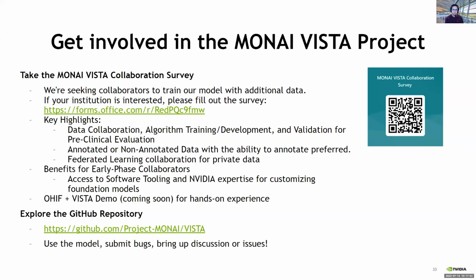One of the other things we're asking about in that survey, and I'm part of the team helping with this, is having a demo that we can stand up for you to test it out in its current form. Right now we have an OHIF plus Vista demo that is almost done, and that we'll be able to stand up on an AWS instance and send you a link. It's not publicly available right now because we don't have the infrastructure set up to scale that yet. But if you are interested in collaborating and you want to see a demo, fill it out. In the survey, there's a question that says, I would like to see a demo of it, and can we contact you to set up that demo experience?